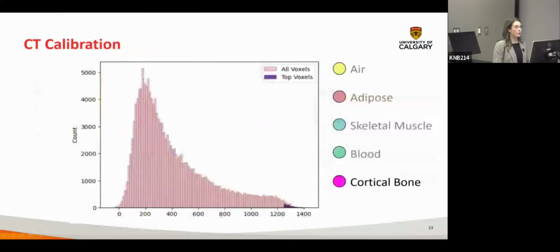So going back to cortical bone and how we're actually selecting our ROIs for that. We have two different methods of doing it. The first one is to manually draw for the cortical bone. We typically like to do this in the femoral diaphysis, to draw in that nice cortical shell. However, with CT scans done clinically, we don't always get that option if they cut them off higher, say at the femoral head.